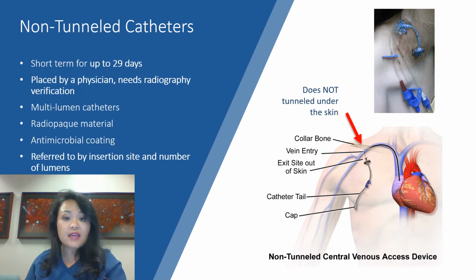The catheters are made of a radiopaque polyurethane or silicone with single or multiple lumens for infusions and monitoring and or for blood draws. Some of these catheters may have antimicrobial surface treatments, and if it does, the catheter will state AGB+. For a multi-lumen catheter, the distal lumen is designated for central venous or CVP monitoring, TPN, and also for continuous infusions. The distal lumen should not be locked except with a provider order.